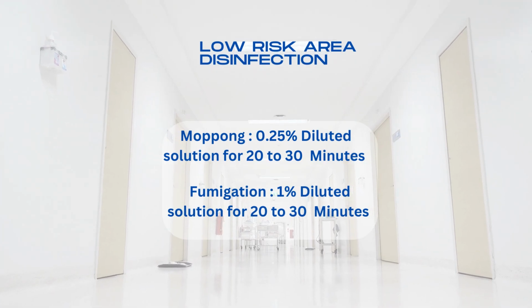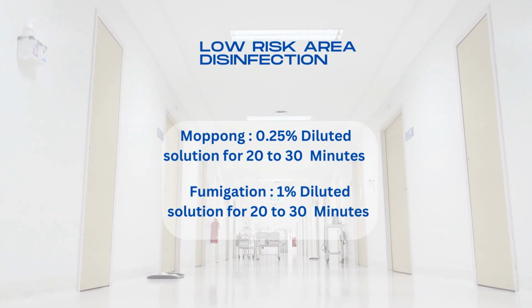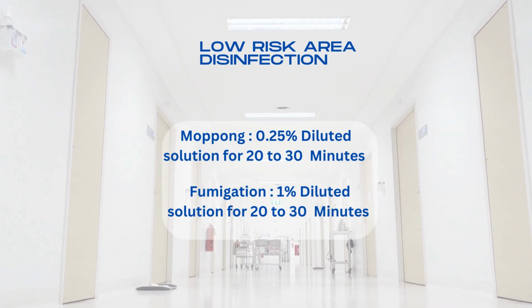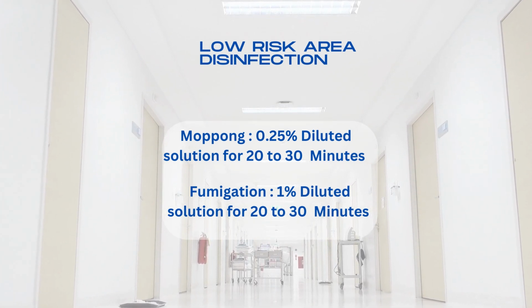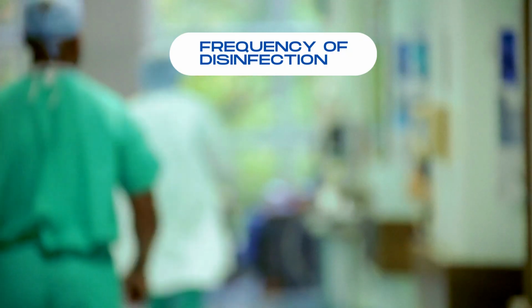0.25% diluted solution is prepared and is used for mopping of the surface of the low-risk area. The same solution can also be used for spraying on the surface. The contact time of 20 to 30 minutes is allowed for disinfection to act properly. The 1% solution is used for fumigation of low-risk areas for environmental disinfection.